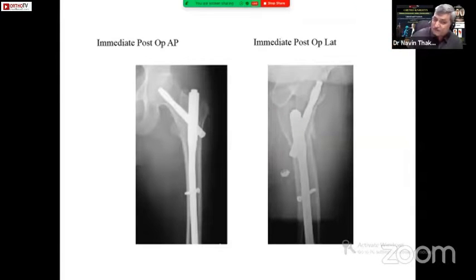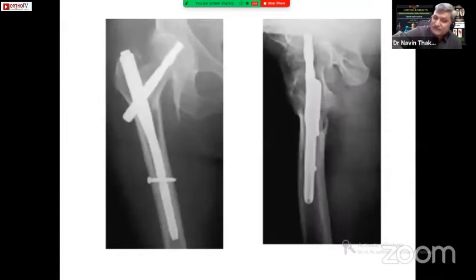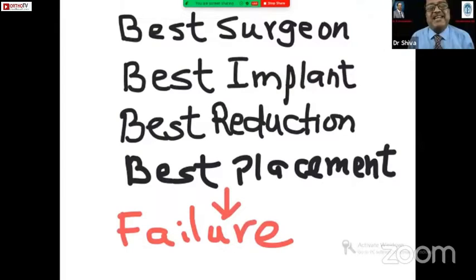That is the issue. That was not noted by the surgeon. Intra-articular breach or a post-operative breach can occur just like DHS. That is the same thing. This case is not included. Next. Okay, no issue.